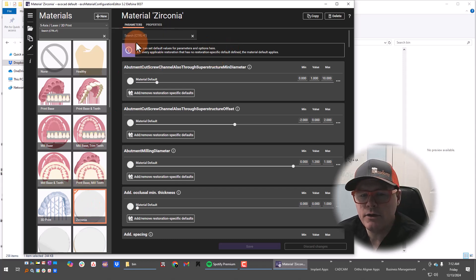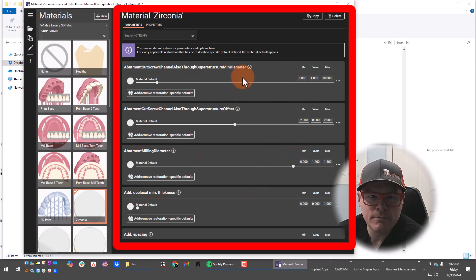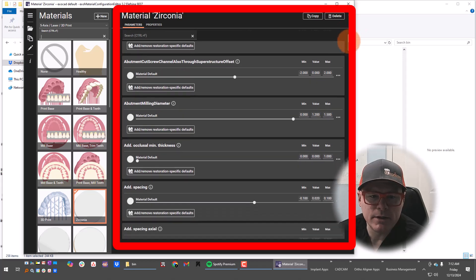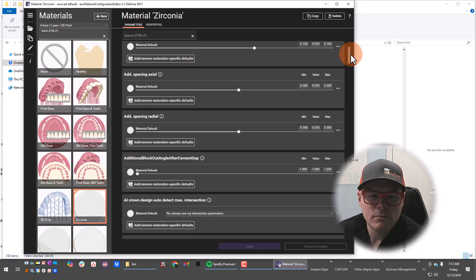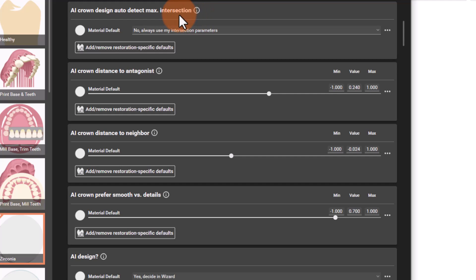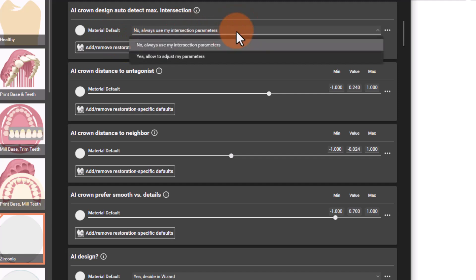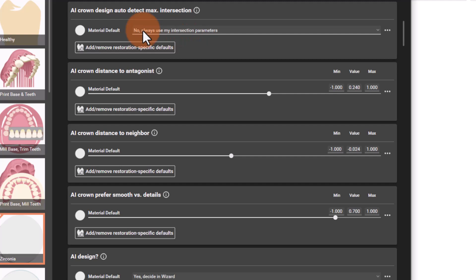Here are all of the configuration options in the main window for Zirconia. Scrolling down, we get to the settings for AI crown design. We have AI crown design auto detect and maximum intersection. The material default is 'no, always use my intersection parameters,' or 'yes, allow to adjust my parameters,' so you can choose that. The next setting is AI crown distance to antagonist.